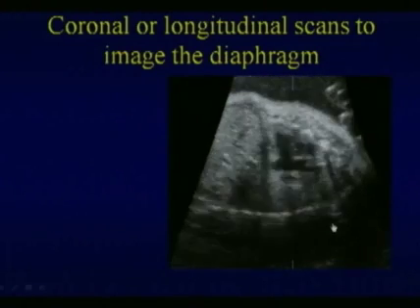Certainly you want to think about diaphragmatic hernia. Certainly if there's any kind of heart displacement or abnormal heart position, you want to consider diaphragmatic hernia. So you have to have a high index of suspicion.